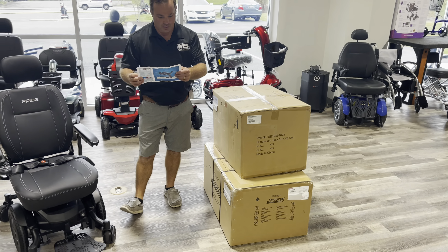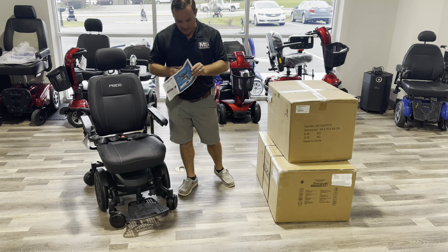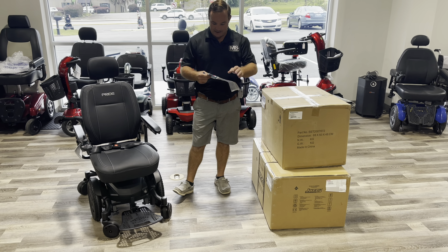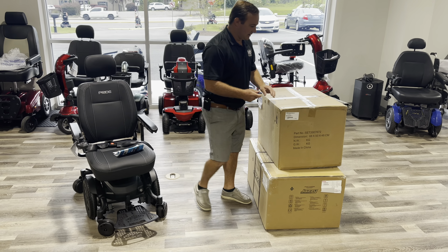Both of these chairs can be ordered with different seats and a lot of different accessories. That's all online - swing away, cup holders, there's a bunch of stuff you can order. So let's just go into this.